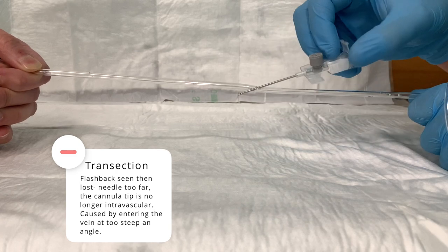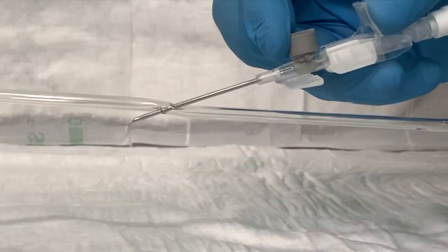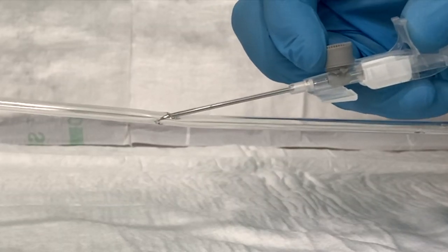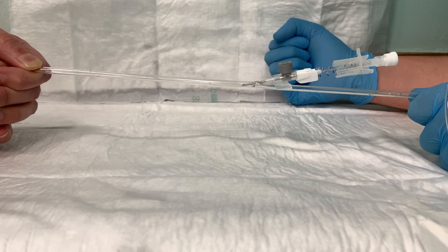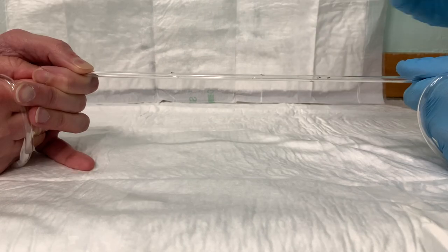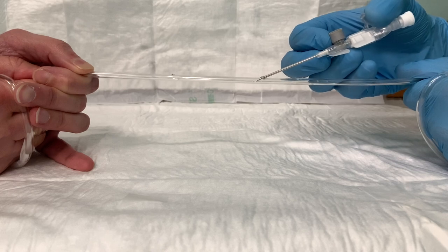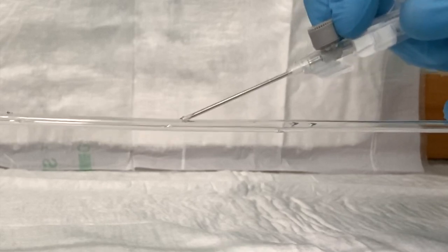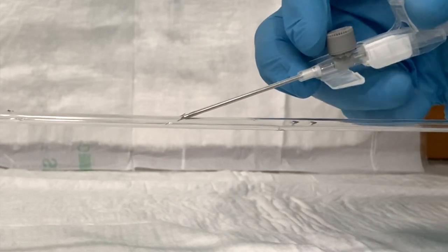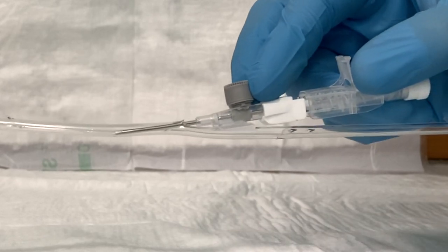To troubleshoot transection, pull everything back until you regain blood flow, lower your angle, and try pushing the cannula up into the vein — if the vein is big enough it will usually work. The converse problem is getting the needle bevel into the vein but not the plastic cannula tip, so threading fails because the plastic abuts the vein edge. The solution is to push the needle forward again, advance everything a couple of millimetres, and then try to advance the cannula again.